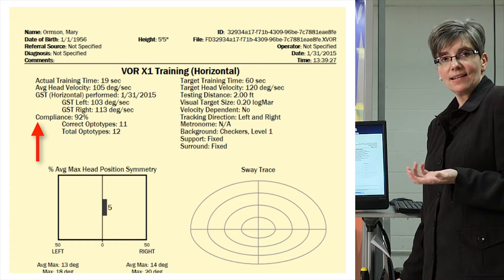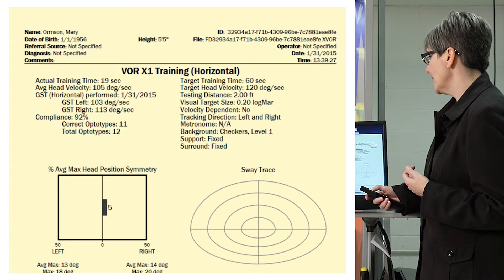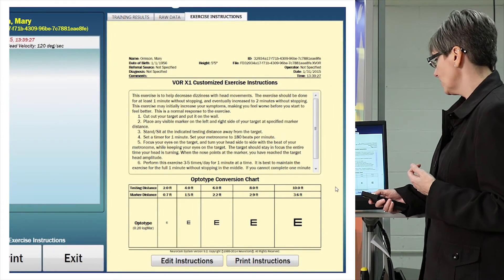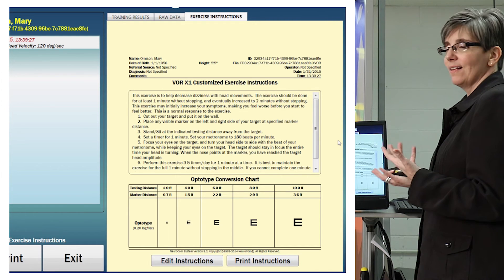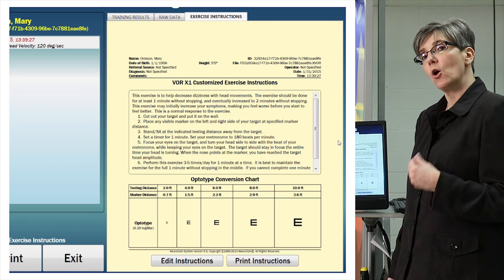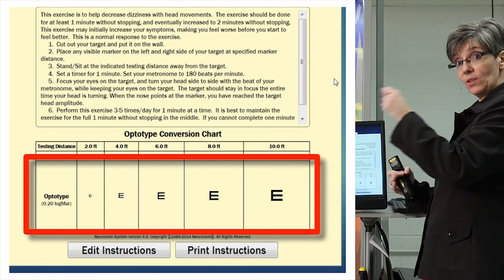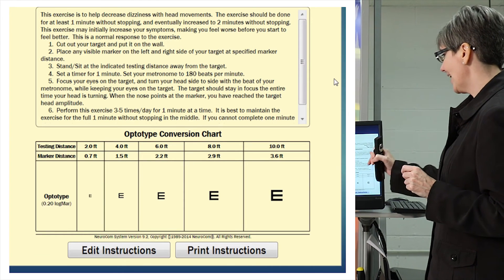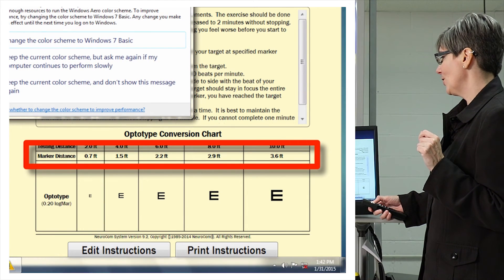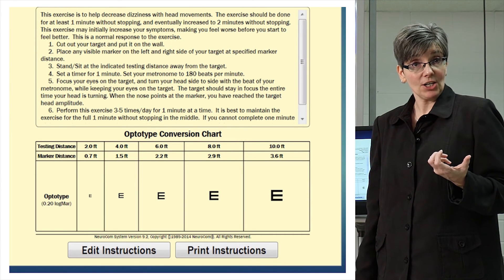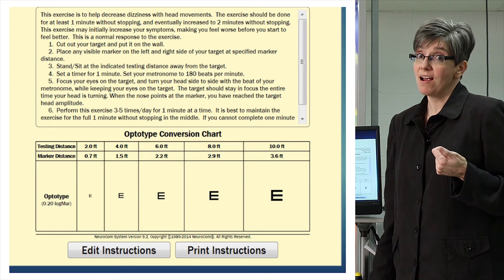We're also able to see her compliance — was she doing the appropriate level of difficulty for the exercise? The exercise instructions are in my mind the most valuable piece of this software, because they allow us to give specific exercises to the patient when they go home. We have appropriate optotype sizes for different distances from the wall, and we include markers so the patient knows how much amplitude to turn their head — ensuring they exercise at exactly the right level of difficulty to improve their VOR adaptation.